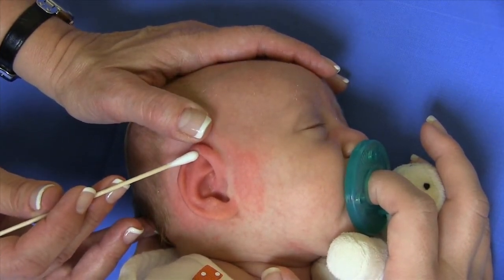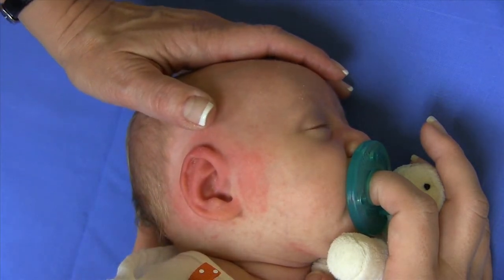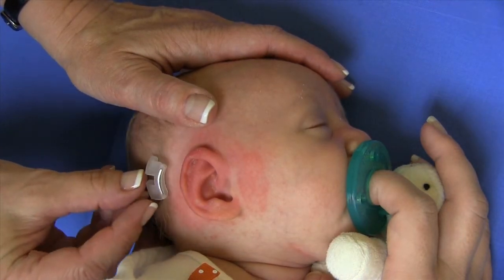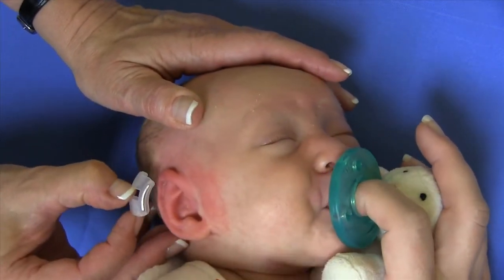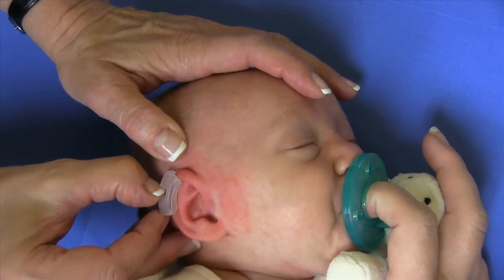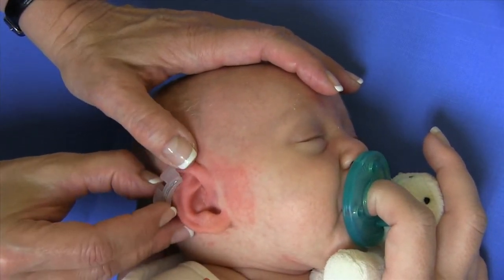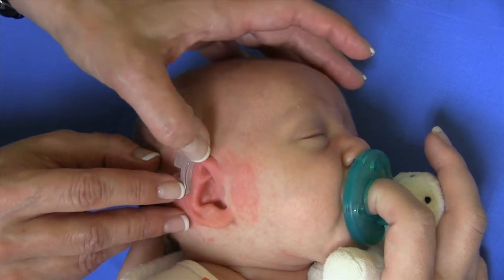But if we stretch that up just a little bit more, we should be able to achieve a much better result. So what I'm going to do is use just a retractor — this is our retention taping, and this is a large retractor. I'm going to sneak it up and put it so it's really lifting right at that helical rim, and we're going to tape that down. You can see how we've kind of lifted that.